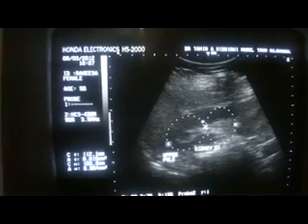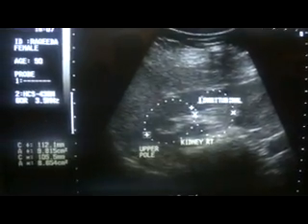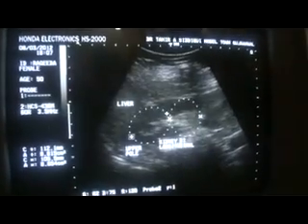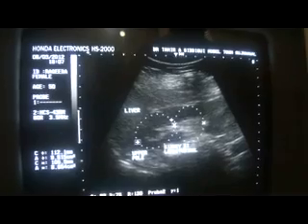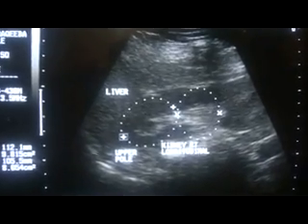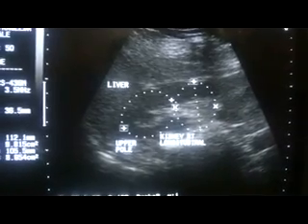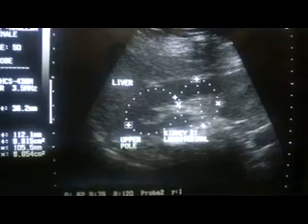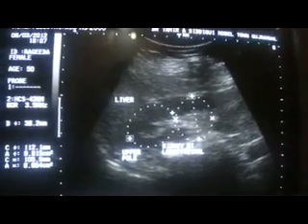This is the upper pole and mid region of the right kidney shown in longitudinal section, with the liver parenchyma visible alongside. Part of the right diaphragm is also seen. The anterior-posterior diameter is more important than the length; it measures 3.8 cm, within normal range, as it should not exceed 5 cm or be less than 2.5 cm. The measurements of the right kidney from upper pole to mid pole are within normal.